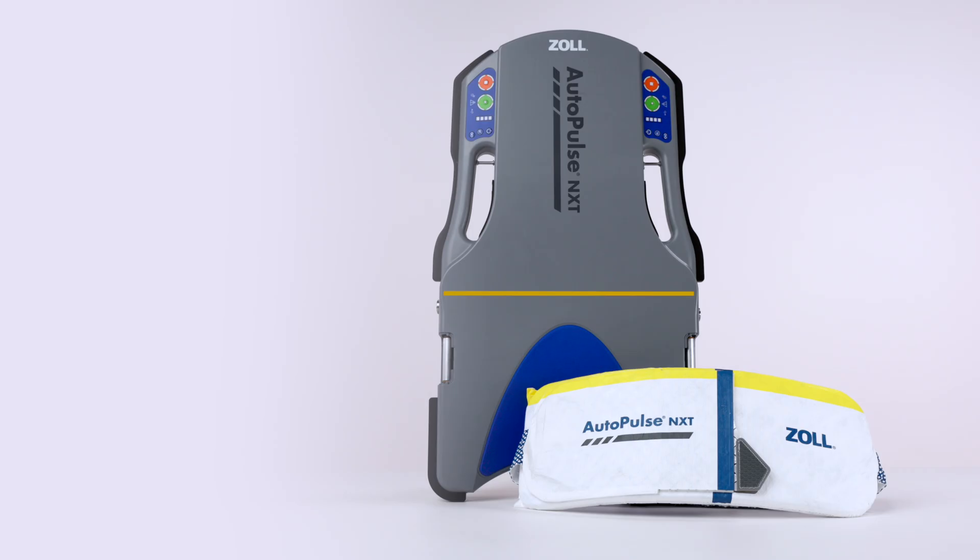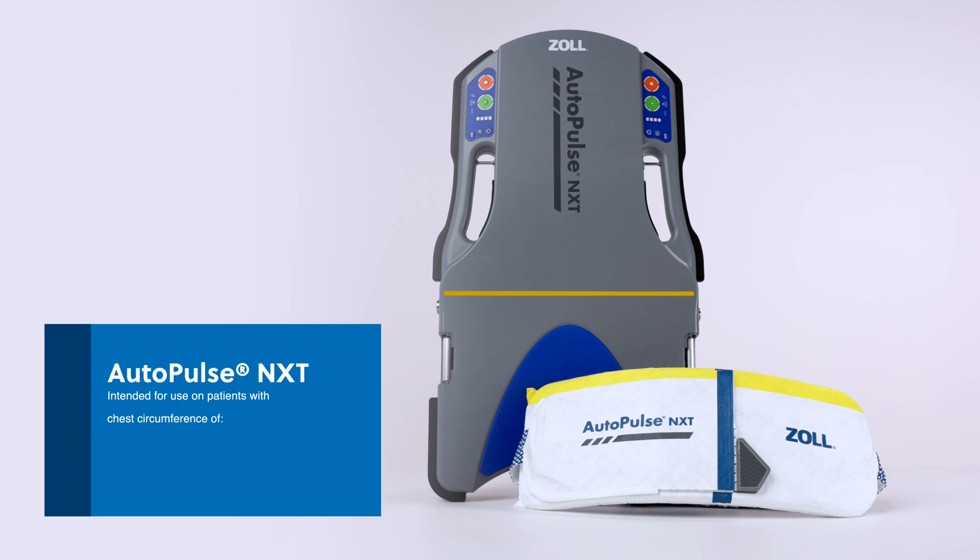AutoPulse NXT is intended for use on patients who have a chest circumference between 30 and 56 inches or 76 and 142 centimeters, a minimum chest width of 9.8 inches or 25 centimeters, and a maximum weight of 400 pounds or 181 kilograms.